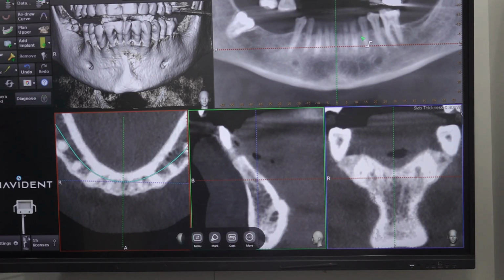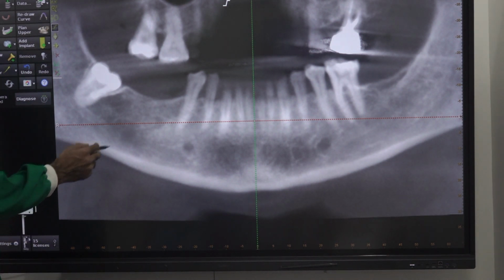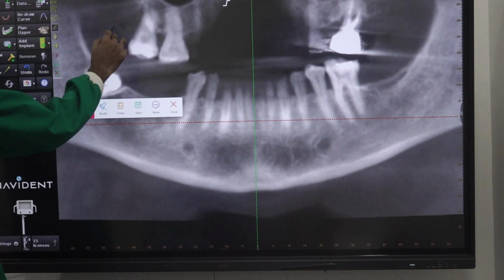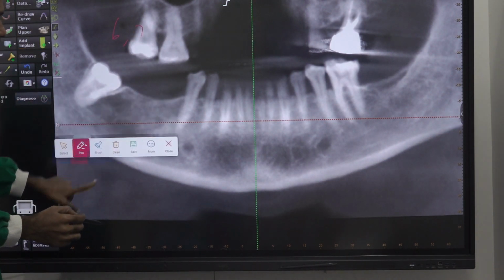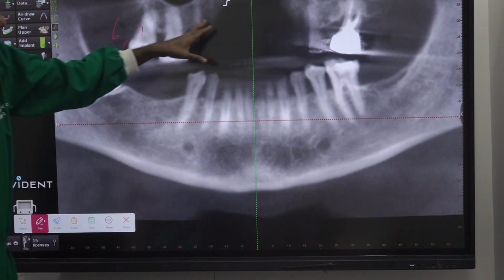So this kind of situation we encounter frequently: replacement of lower molars, heel area. So what things to look for? In this case, both 6 and 7 we are replacing. Lower, what is the plan, sir? Now, the lower molar and the upper molar.